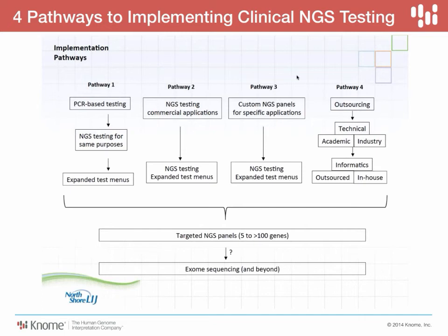Pathway 3 is a little bit more aggressive, or perhaps actually more current, and that is there are a lot of labs that are just getting started, brand new labs, or labs that are going from other testing paradigms altogether and moving into sequencing. And they're acquiring these now much more affordable NGS systems, and they're building custom panels. Typically, these are driven by the requests coming out of the clinicians at their hospitals, the kinds of tests that they would be looking for. And so they're going to build these panels straight out, kind of like I was doing and showing how you could do with building up an epileptic encephalopathies panel.